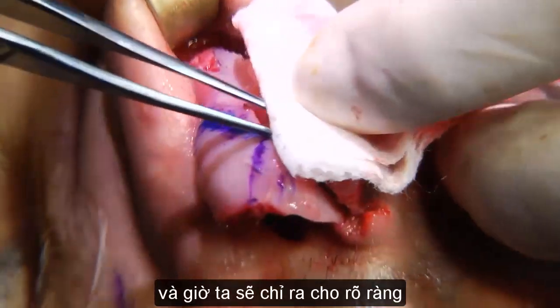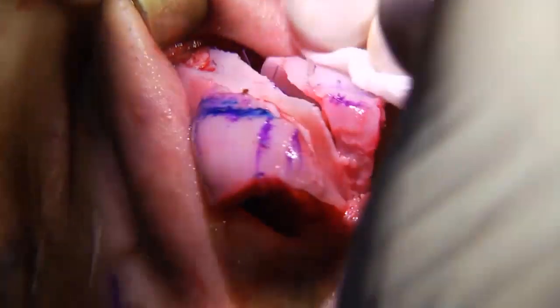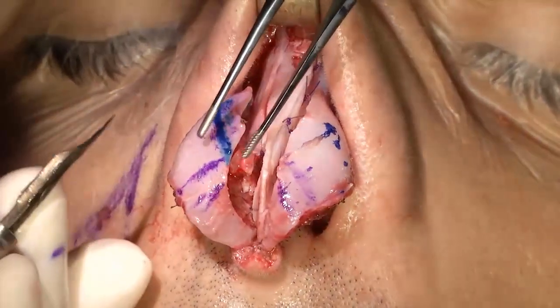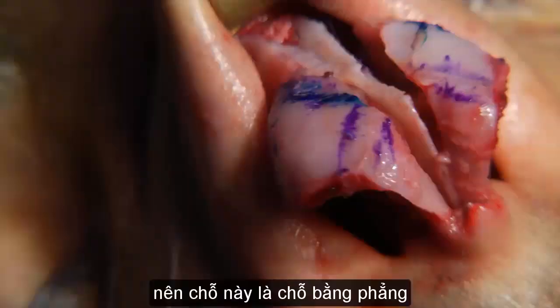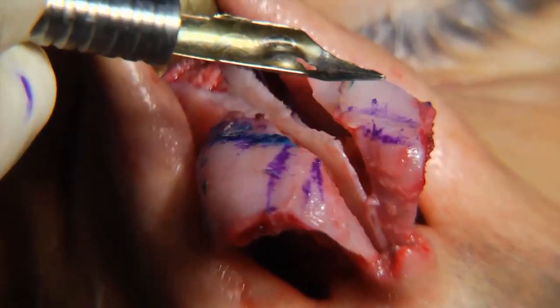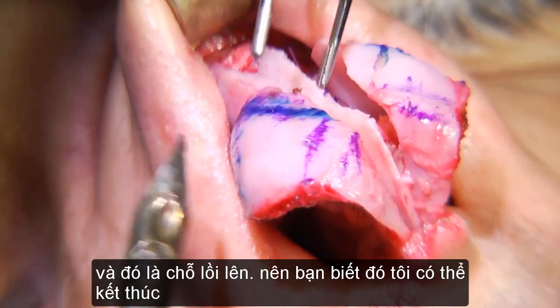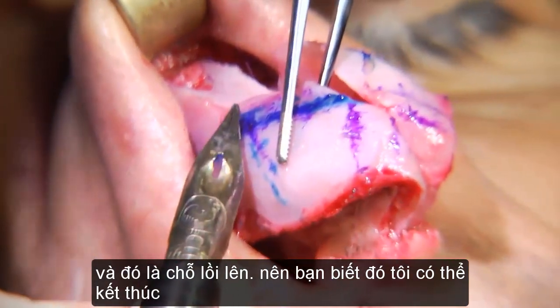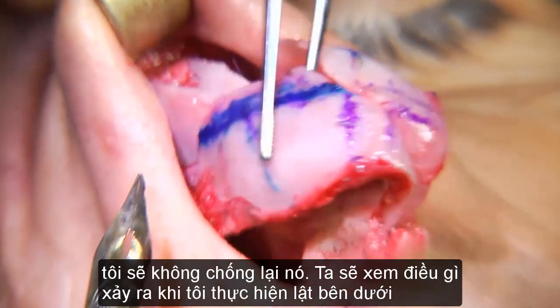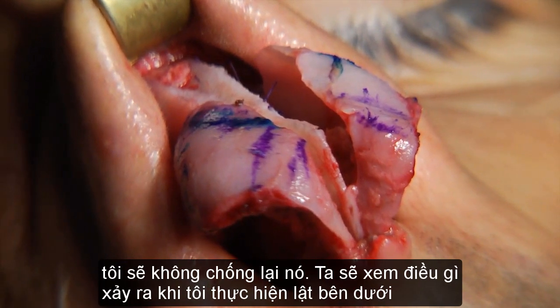So let's figure this out clearly. We have a convexity problem, and the convexity is here. So this is the flat area. And that's the convexity. So, you know, I may well end up doing two things here. I wouldn't be against it. Let's see first what happens when I do my turn under.